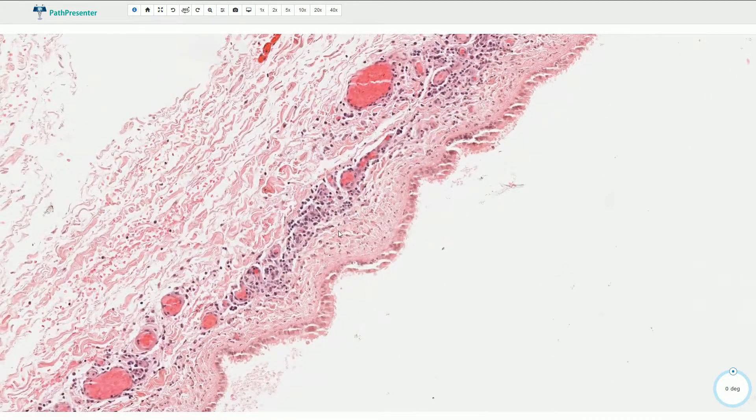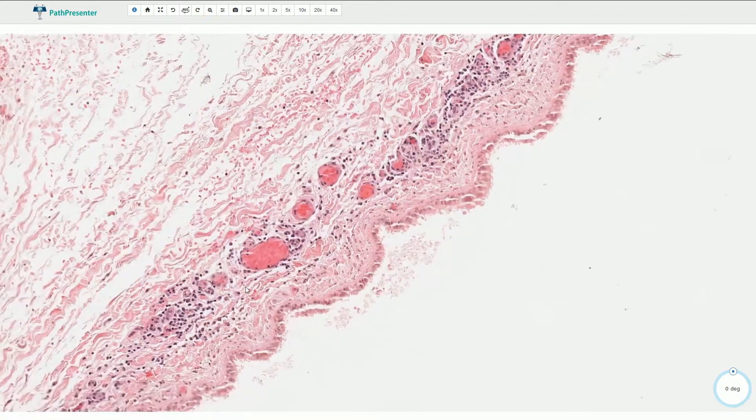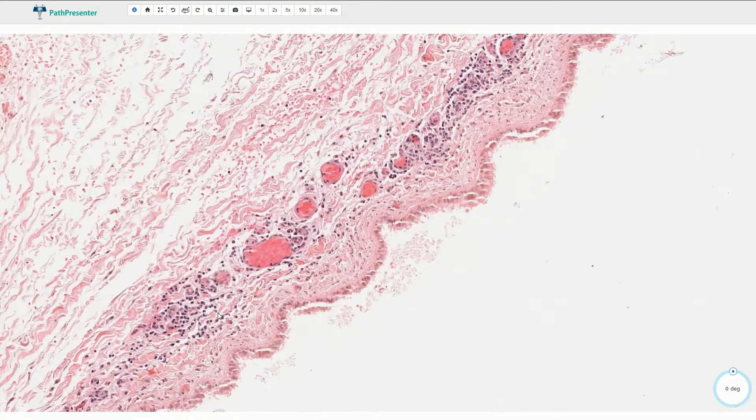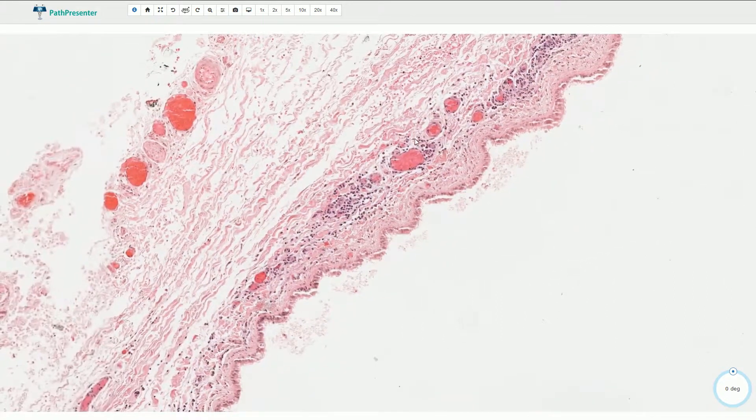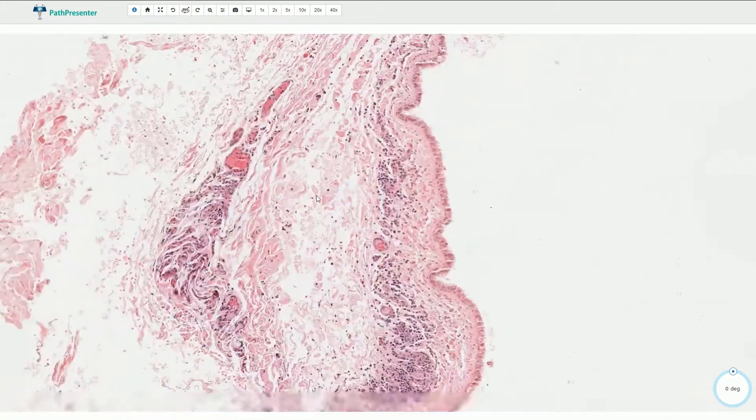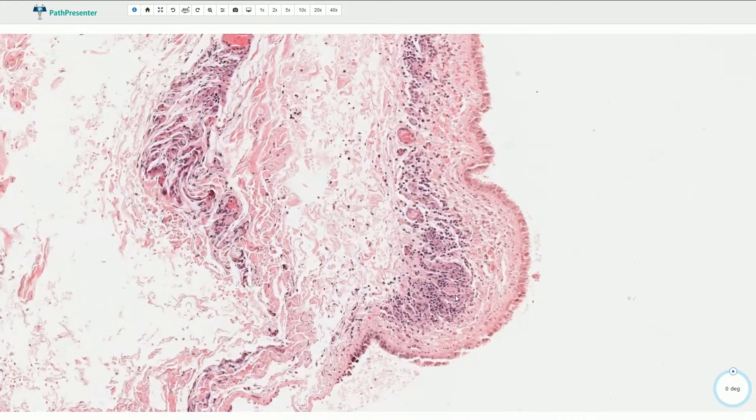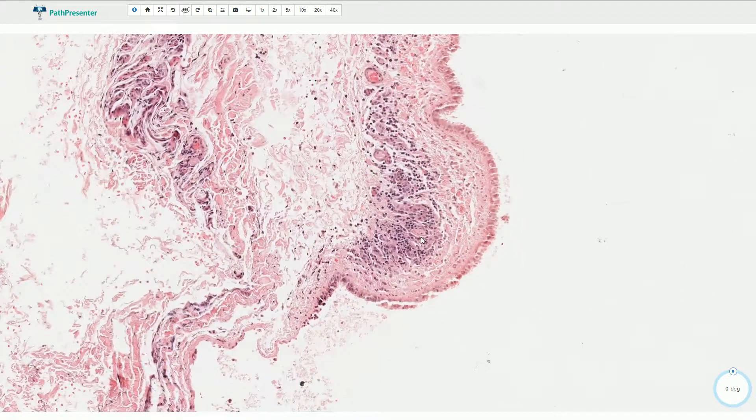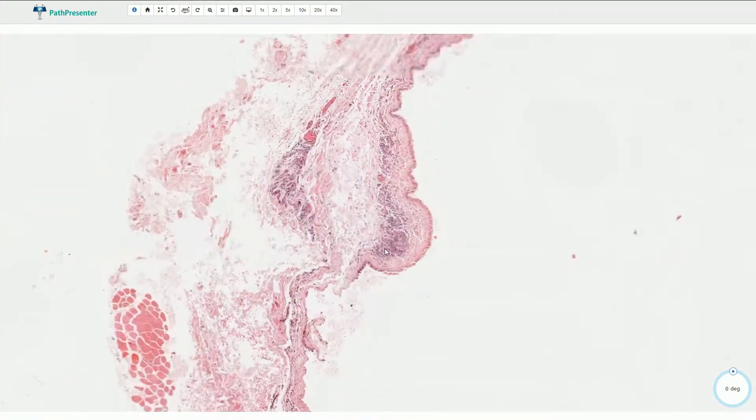And underneath the epithelium we have a stroma with some mild chronic inflammation, some blood vessels, and we can also typically find some mucoserous glands.